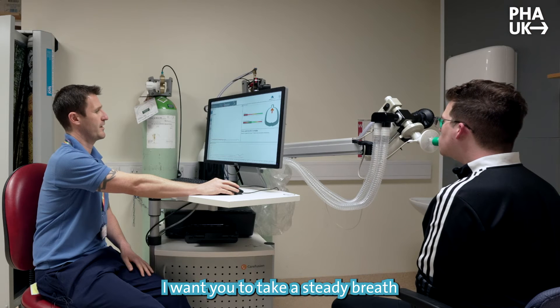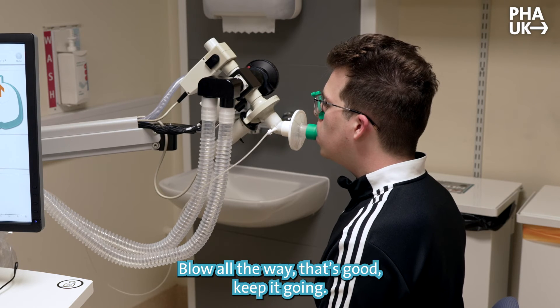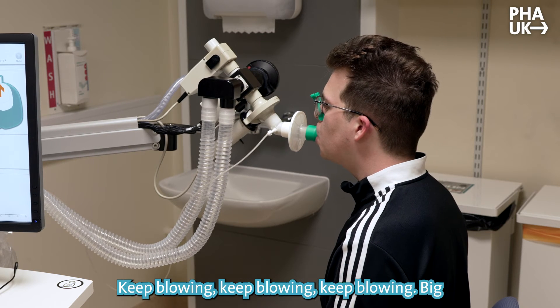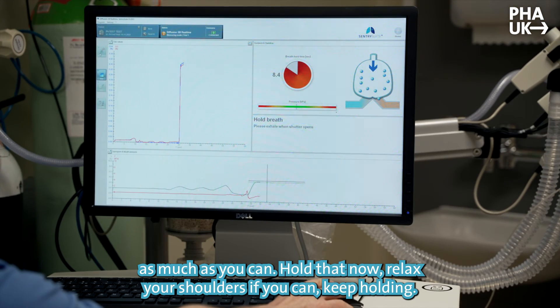I want you to take a steady breath in for me — so breathe in, and all the way out now. Blow all the way. Keep it going, keep blowing. Big suck in as much as you can, suck up right into the top as much as you can. Hold that now.